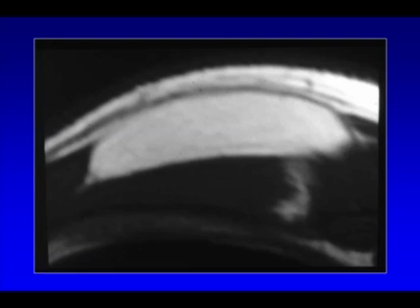This is another characteristic appearance of lipomas, these preserved septa that one can see within the mass. Now this patient had had a history of melanoma and was being sent for a new palpable mass, so I wasn't completely comfortable at this point of letting this go, and so I wanted to get correlative imaging to prove that this was in fact a lipoma. Here's the MRI showing the lesion, which actually tracked with fat on all pulse sequences, indicating that in fact it was a benign lipoma.